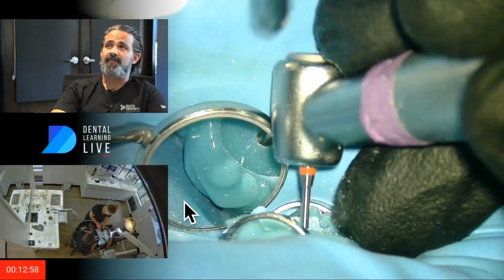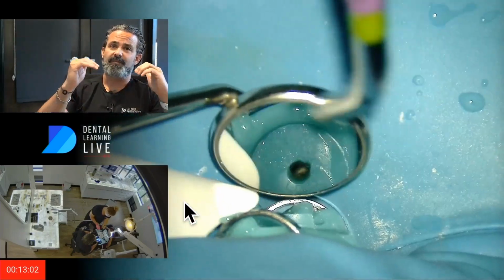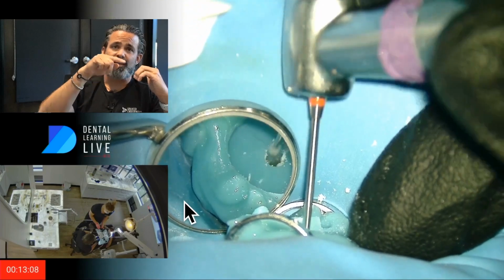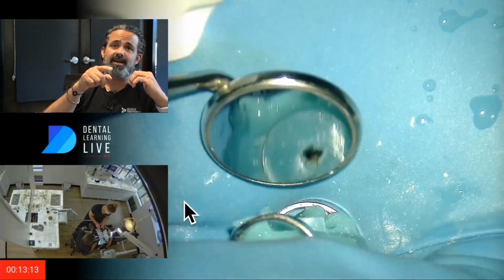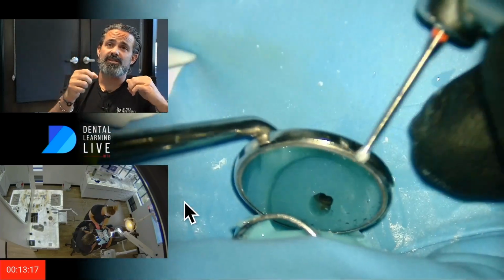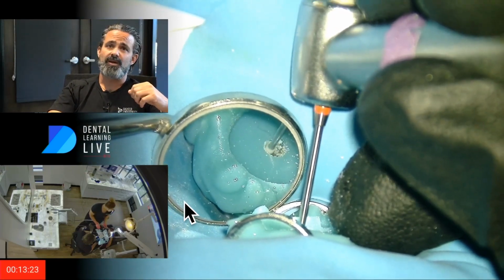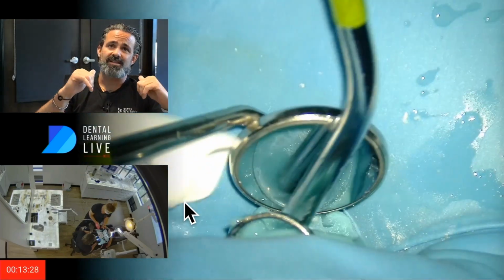I feel like I watch the bubble close, and when I feel like there's any undercuts or something like that from Sound Seal in my access, I feel like it's not a smooth flow, and it affects that bubble. And I could be making that up in my head, but it's what I feel like. And when I do this, I just usually get a consistent bubble. I just feel like I'm really controlling the energies of the MOA, mechanism of action, correctly. And so I like to just kind of finesse the Sound Seal.